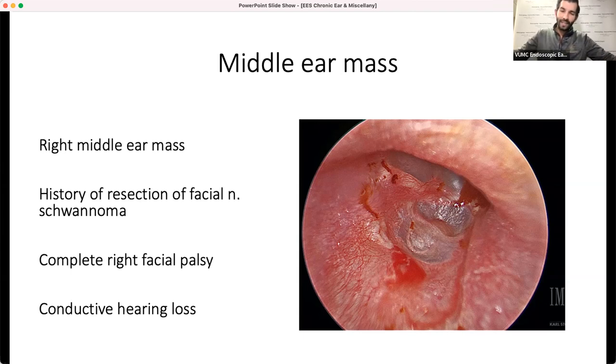I have before, but I don't know. I think for me, I like the comfort and security of having an intact flap. And I know that this is the common argument against that. But I also readily admit, just like you did, there's no good evidence for or against it, right? But I value having a nice, broad, large tympanomeatal flap that I can set down at the end of the case and be confident that the epithelium is still healthy and it's going to help to re-epithelialize that graft.